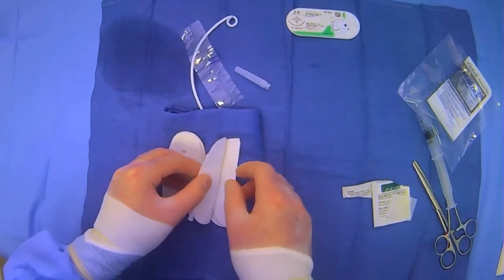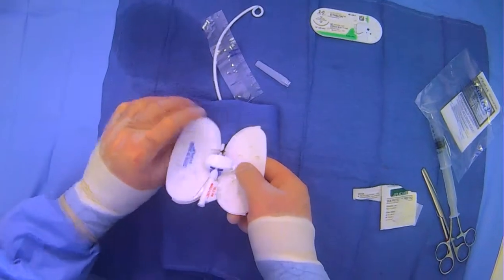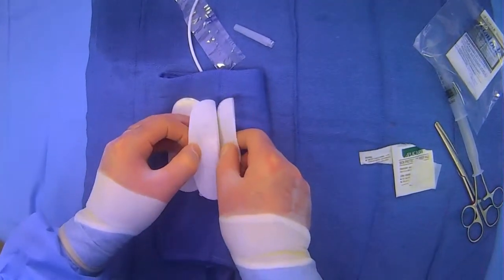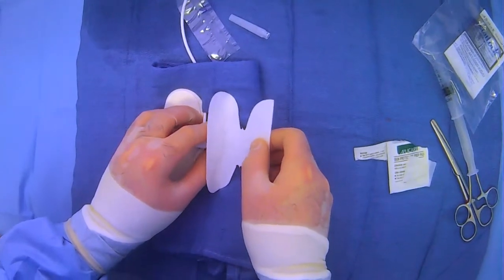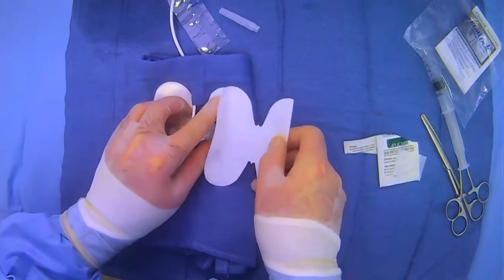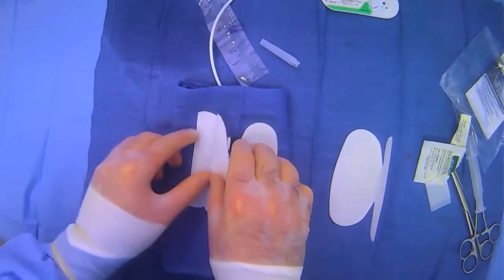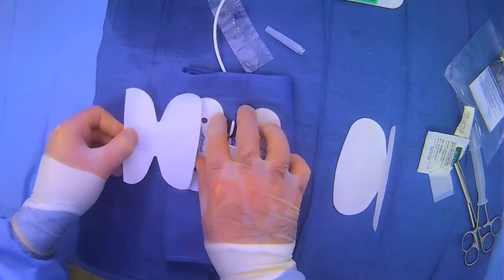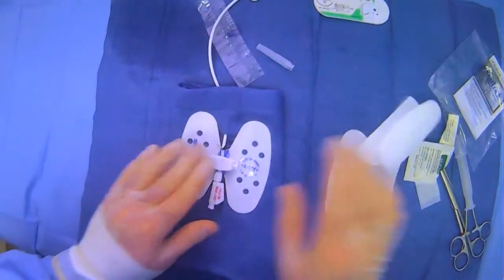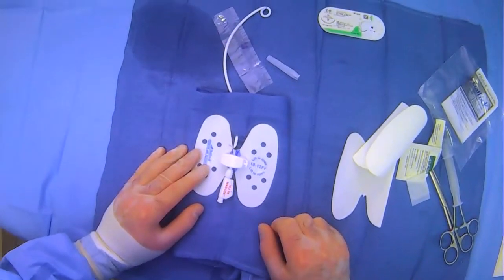Then come to one side, peel away, and stick. We're sticking down here, and then stick as you're peeling away so it doesn't move. Then you can do the same thing on the other side — peel away and stick. And now you have your tube that's been stat locked into place.